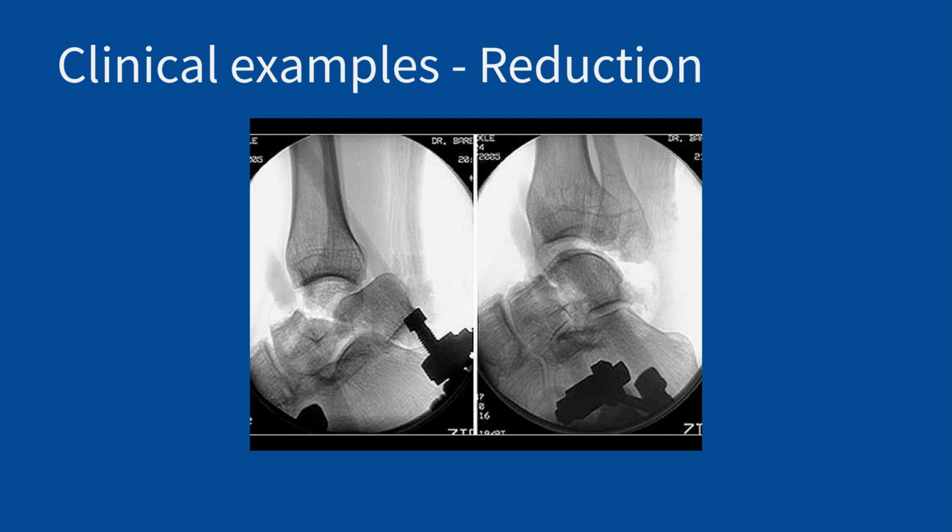Here, a nice example of open fracture reduction in this patient with a pretty significant talus fracture. You can actually manually manipulate that fracture and feel that go back into place, right? And similarly in imaging, it's quite nicely demonstrated how you have adequate alignment at the end.